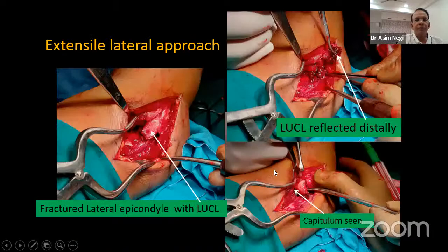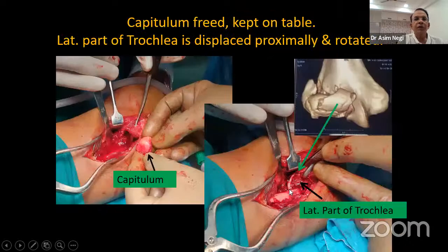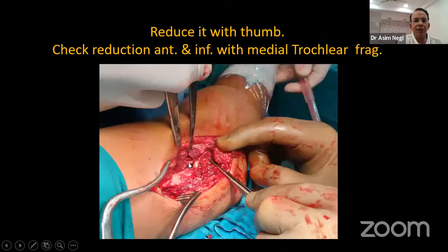Same extensile lateral approach. Here, the lateral epicondyle is attached to the LUCL complex. This is one piece with avulsion of a bony chunk. It is reflected distally. Now you are seeing the capitulum, having done that. Capitulum is again freed and kept on the table. Lateral part of the trochlea is displaced proximally and rotated, again pushed down, as we saw in the first case, getting reduced.